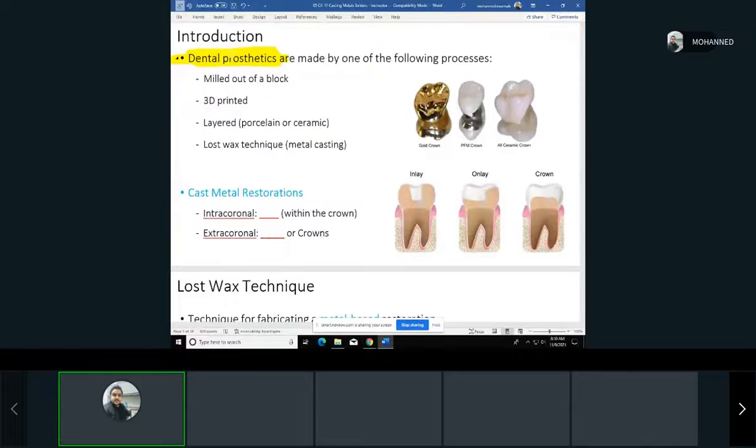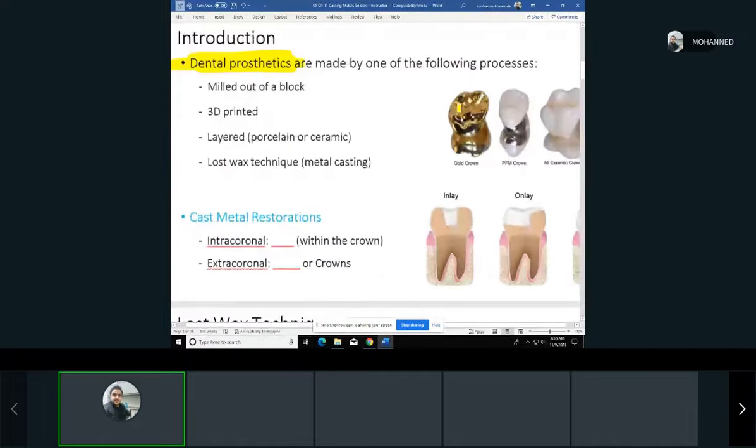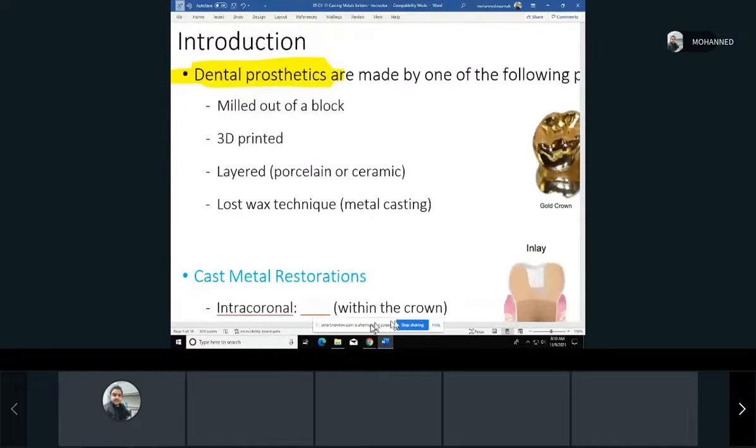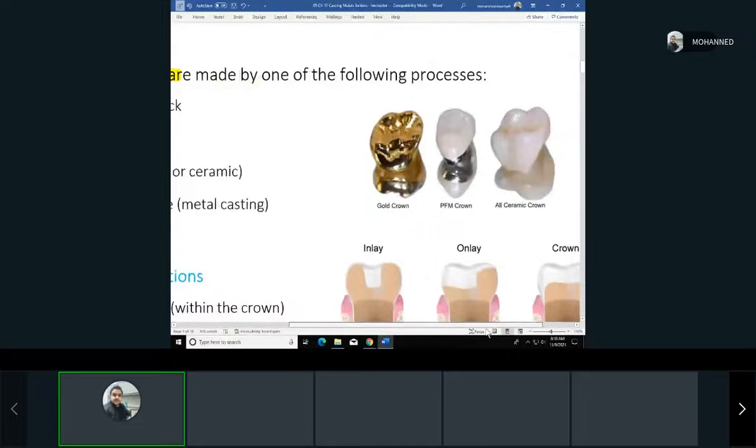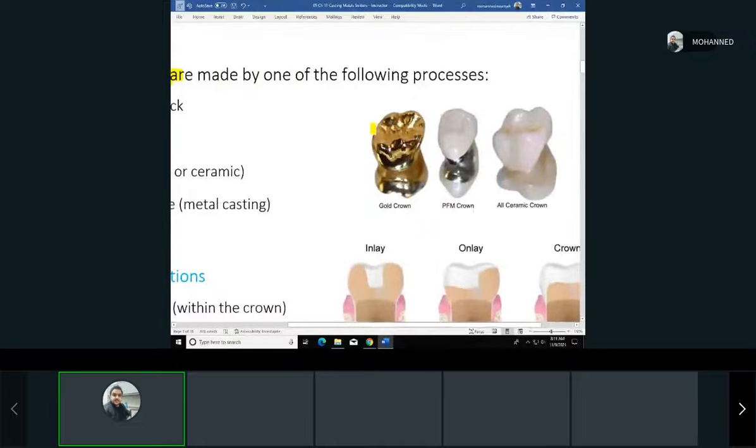So when we think about how these crowns are actually made, anything that is not a regular filling, when we say a filling, composite or amalgam, but other than that, like a crown that is a full gold crown or a PFM, you know what PFM is, right? Porcelain fused to metal. Yes, that was part of your charting, right? And you have all ceramic crowns. So how are these made?